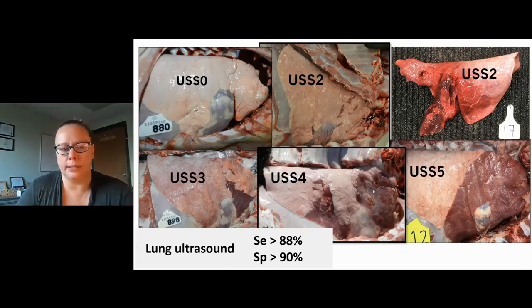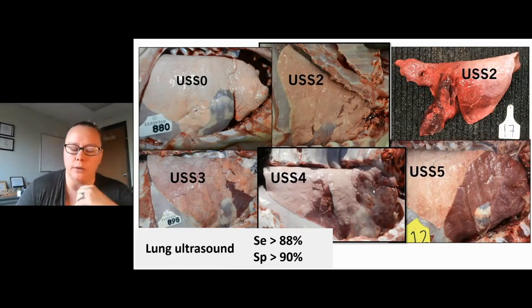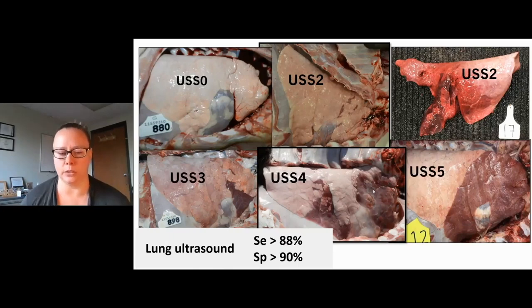Okay, so remember what we saw a few slides ago about how sensitive the cough was. We're much more capable of finding calves with pneumonia when we use the lung ultrasound. I think the sensitivity was about 35% with cough. Clinical signs were probably up around 60 to 65% sensitivity. So if a calf has multiple clinical signs, we can find 50, 60, 65 out of 100 of them. Okay, so hopefully you're getting a picture that the ultrasound is a much more sensitive tool.